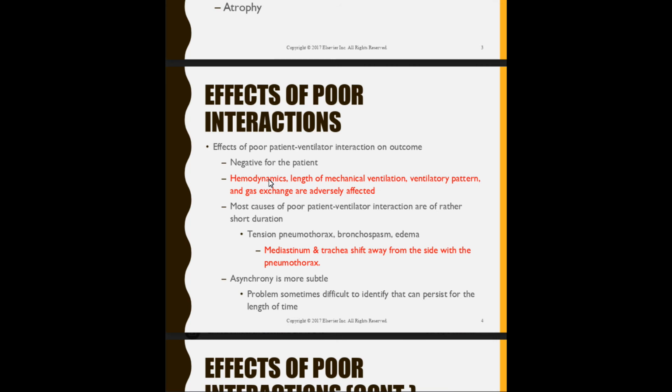Are they exchanging really well? Are they not? Is it because of lack of flow? Is it because of a missed trigger, double trigger, things like that? That's going to adversely affect the patient. Most causes of poor patient ventilator interaction are of rather short duration.